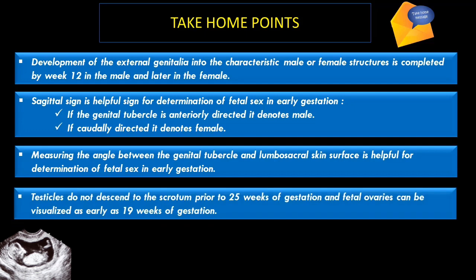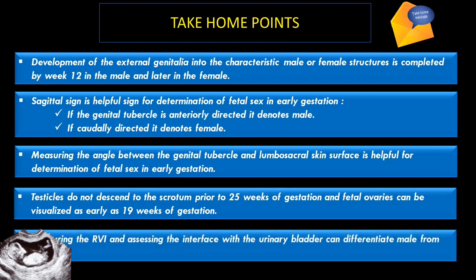Testicles do not descend to the scrotum prior to 25 weeks of gestation, and fetal ovaries can be visualized as early as 19 weeks of gestation. Measuring the recto-vesical interspace and assessing the interface with the urinary bladder can differentiate male from female fetus.